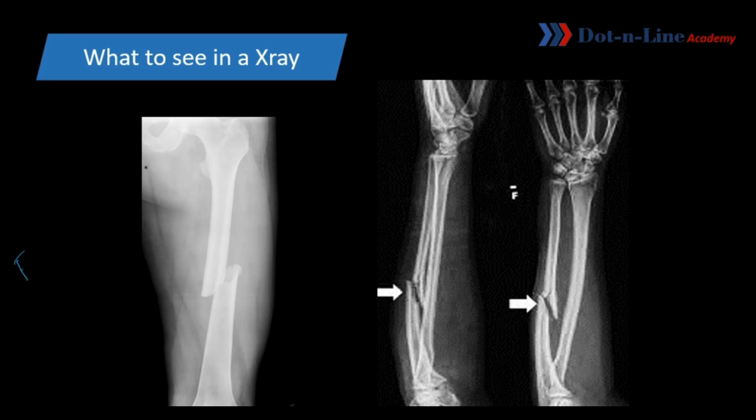So it is a femur. How femur? Relate it with the image of the femur that you have in your anatomy book, right? This is the lesser tubercle. This is the head of femur, the greater trochanter. It is not tubercle, it is trochanter. The shaft. This complete structure is looking like femur.